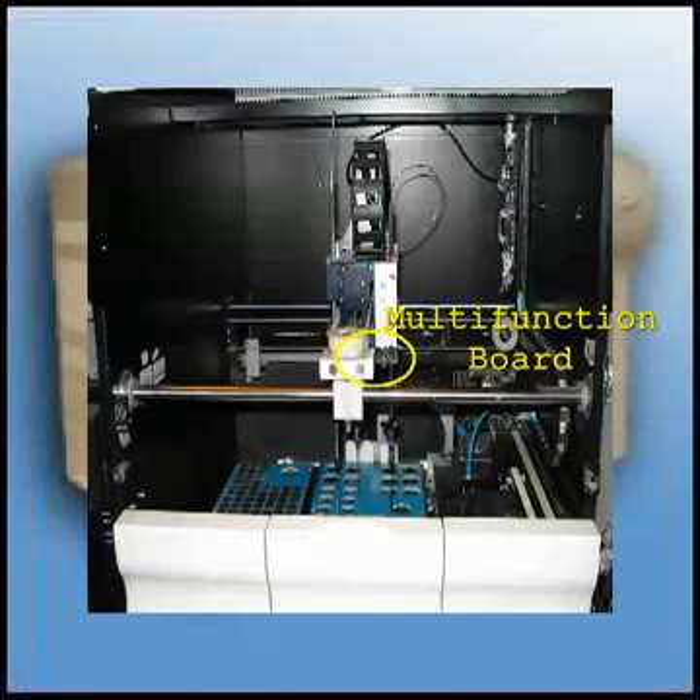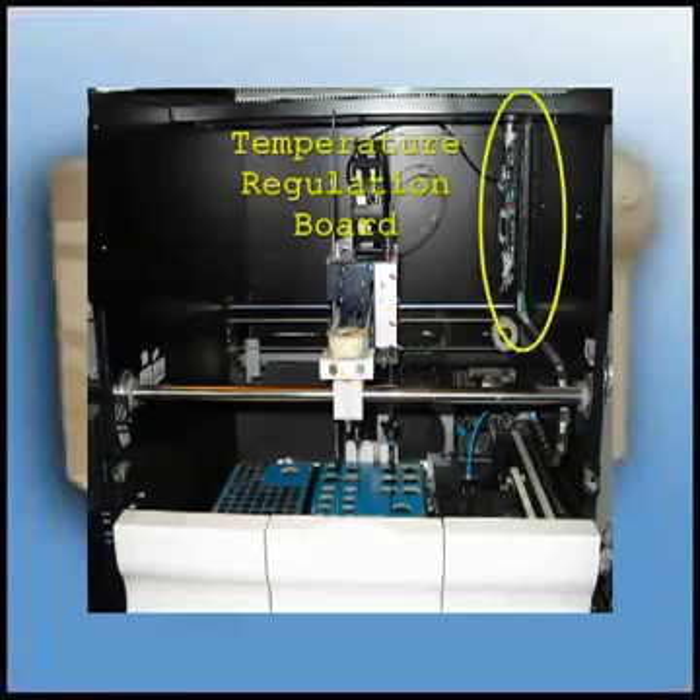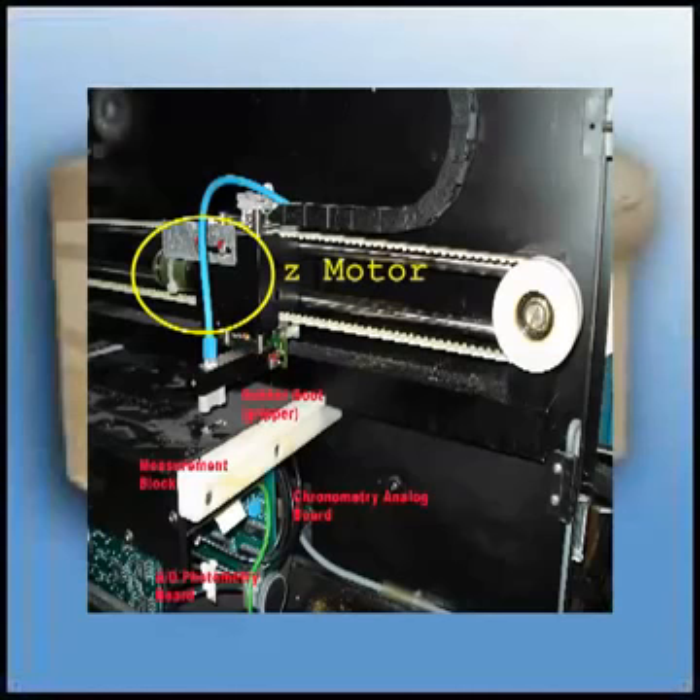In the back right corner is the temperature regulation board. Arm 2 is at the far right. You can see the Z motor here. This Z motor is the same motor that's used for moving the needles up and down.